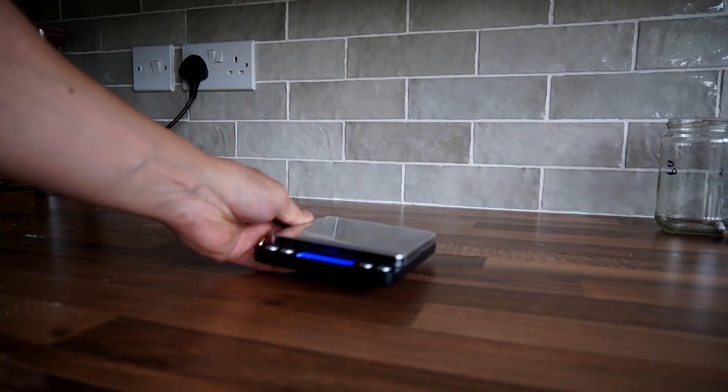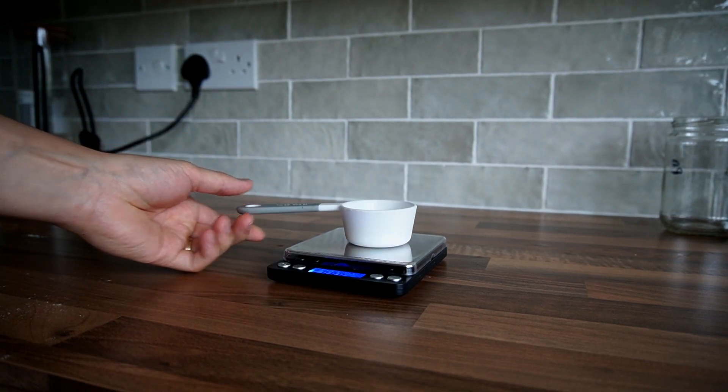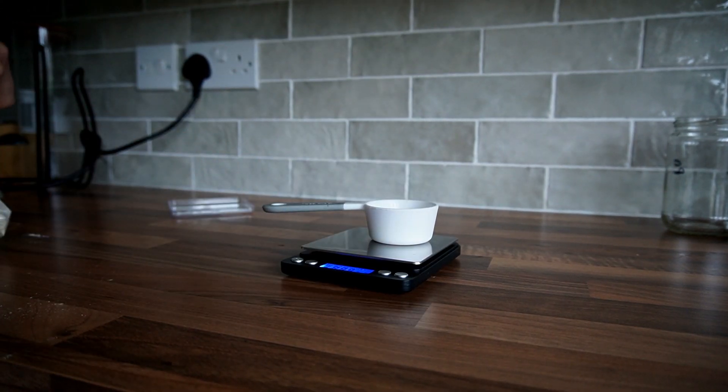So the first thing you want to do is weigh out one gram of light malt extract, then pour this into a measuring jug.